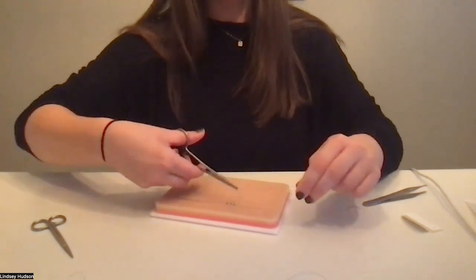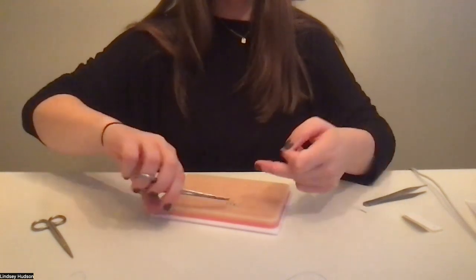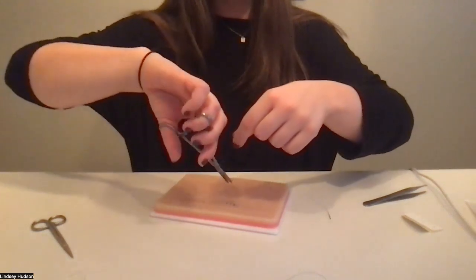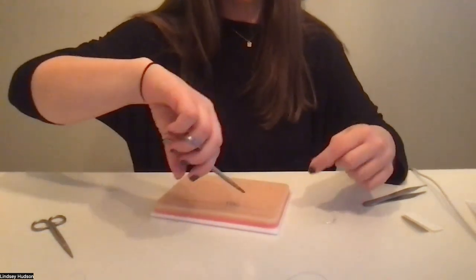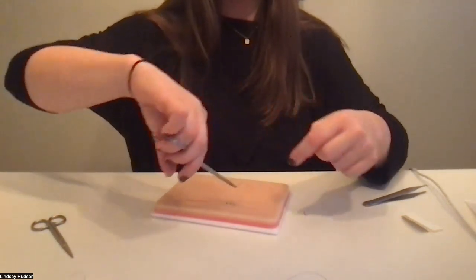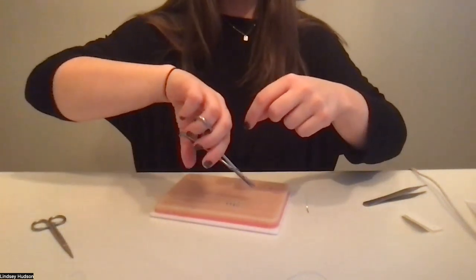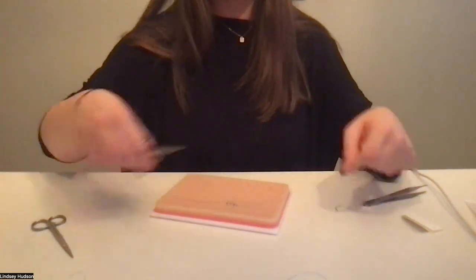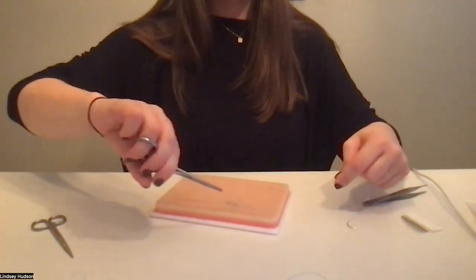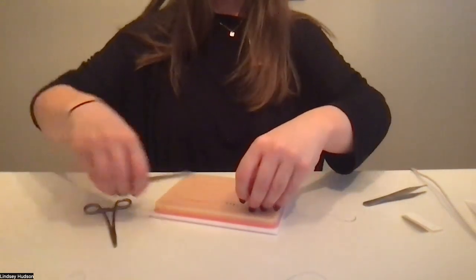Grab your tail and pull it through. Under once. Grab your tail and pull it through. Over. 1 more time, under. We're going to cut.